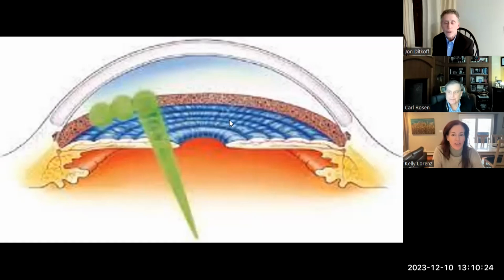Right. And the laser, because of the mirrors inside this lens, bounces off the mirrors essentially and can aim right at that internal drainage system of the eye called the trabecular meshwork. As I mentioned, the ALT was destructive to the trabecular meshwork and caused holes in it, but it's effective because the holes allow for increased fluid drainage internally from the eye. So ALT is effective, but because it does damage to the trabecular meshwork, it's typically advised to do it only once for patients.